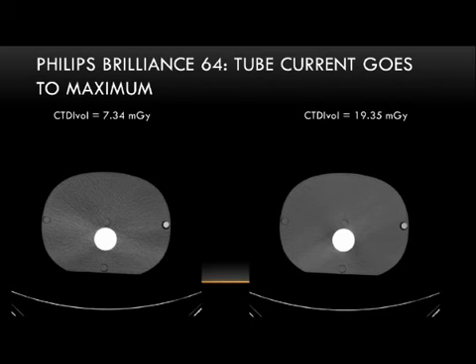So on the Philips system with the full localizer radiograph, right here, these systems can give you a virtual slice CTDI vol that's in a DICOM object. It's not really a CTDI vol, since it's not the proper definition, but it can give you an idea of what the tube output was at this position.